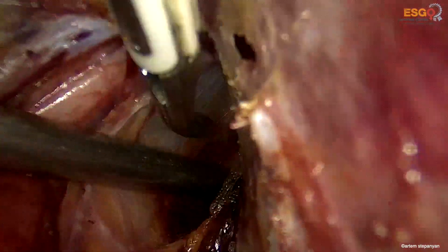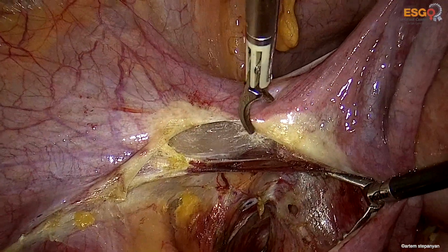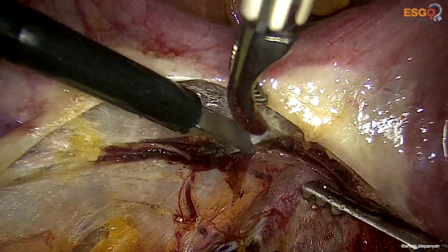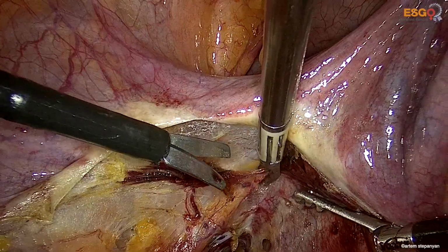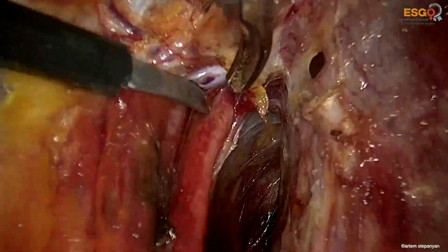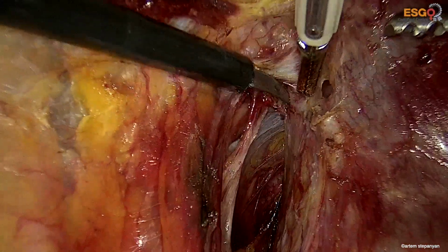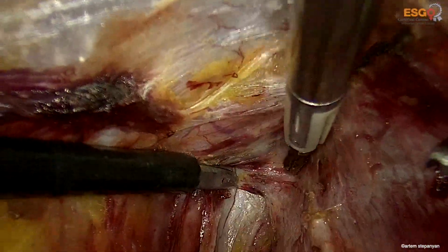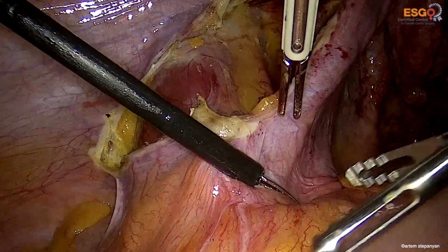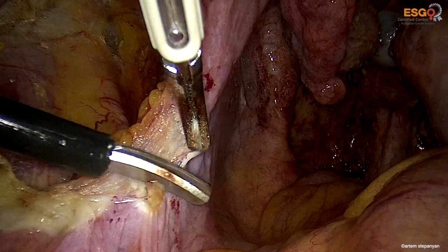This space is very avascular, and the dissection in between those anatomical structures is fast. We continue the detachment of the peritoneum, which is partially detached from the ureter, mesoureter, and the hypogastric plexus.